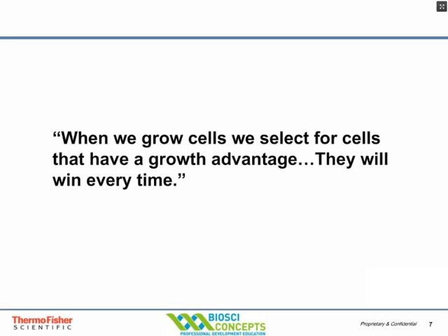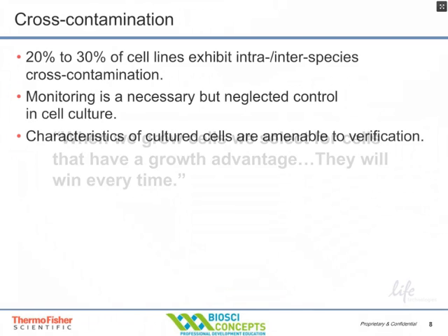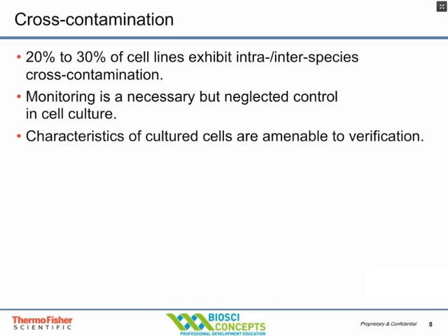When we grow cells, we select for cells that have a growth advantage, and those cells win every time. In addition to selection pressures, this is one of the reasons we have cell line cross-contamination. It's thought that about 30% of all cells used out there have intra- or inter-species cross-contamination. Intra-species contamination would be, for example, thinking you have a human lung cell when you actually have a human kidney cell. Inter-species contamination would be thinking you're using a human cell line when you're actually using a monkey cell line.